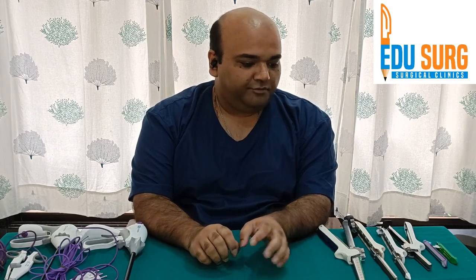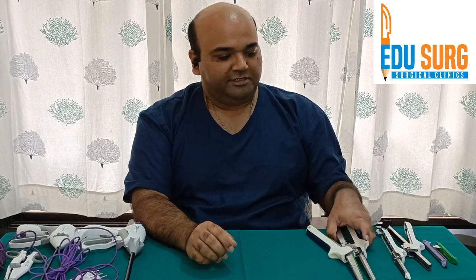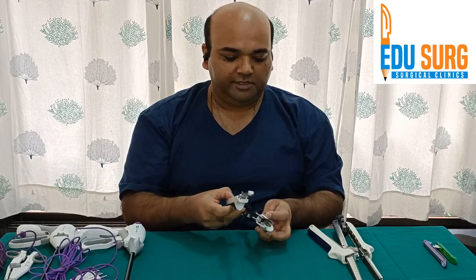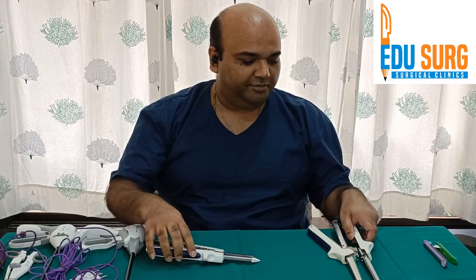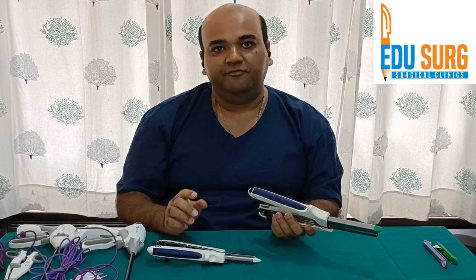In today's video we are going to see the intestinal staplers, how they are used, the mechanism of action of the staplers, and various staplers that are available. You can see some of the staplers here — I am sure you have seen these in your OTs as well. This is the GIA stapler of Covidien, used in open surgery. We will also see laparoscopic staplers in upcoming videos.